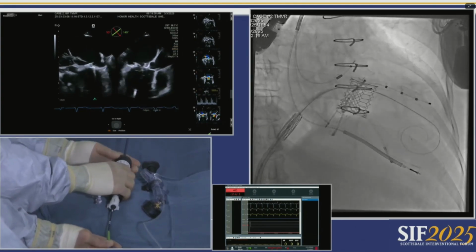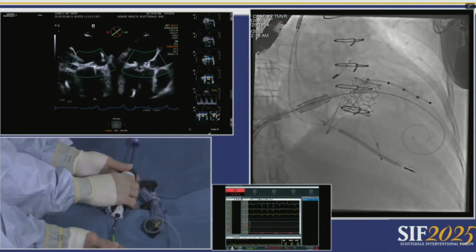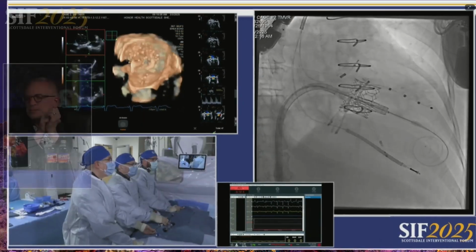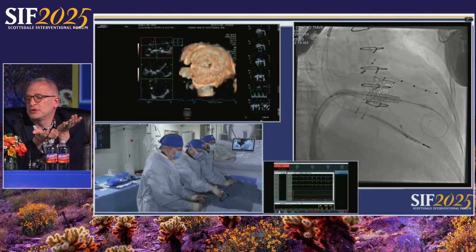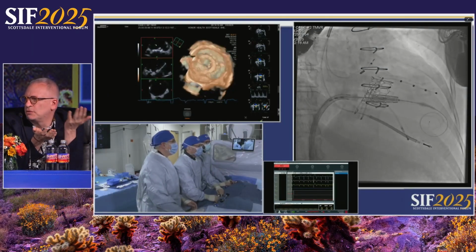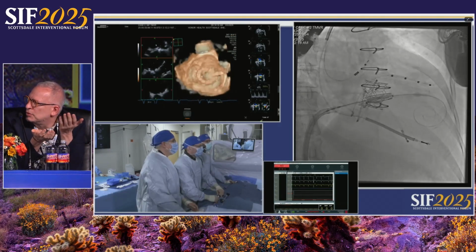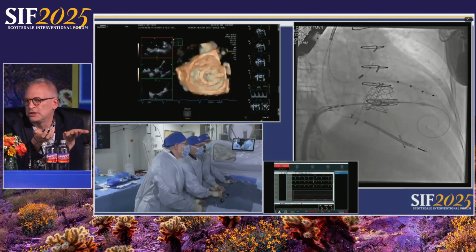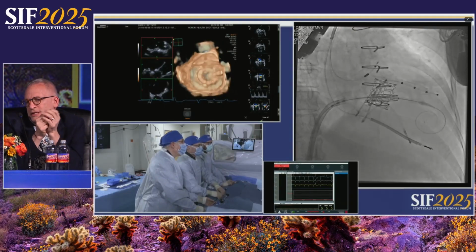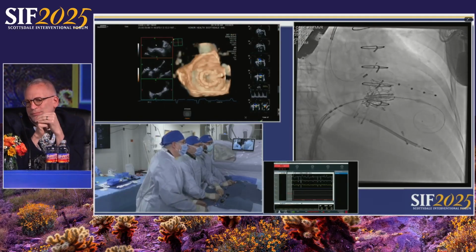So I think 23 is the right size here. The AP diameter on that ring originally is about 19, so you're never going to get a 26 to fully open here. There's no risk of LVOT obstruction, right, because the patient's alive now, and the anterior leaflet, assuming it wasn't modified, is already draping around the valve. So the neo-LVOT measurement's not all that important, right? You're going inside a valve that's already covered. So I think 23 is the right size, and I would try and make it as circular as possible, so you should be prepared to put in a true balloon.